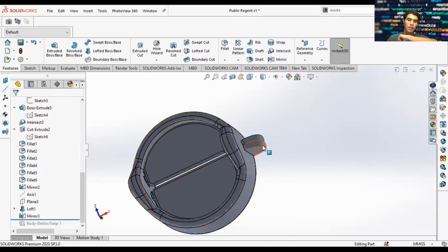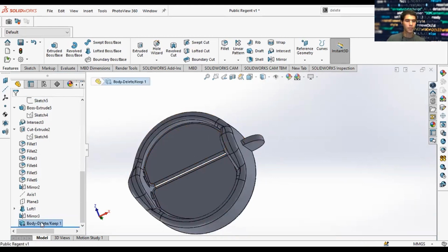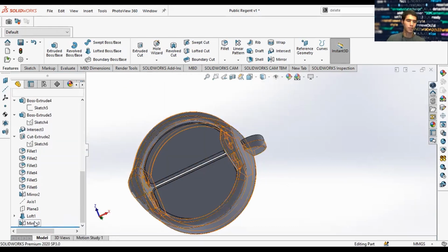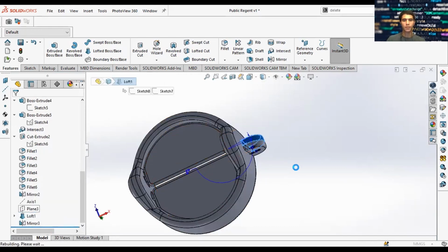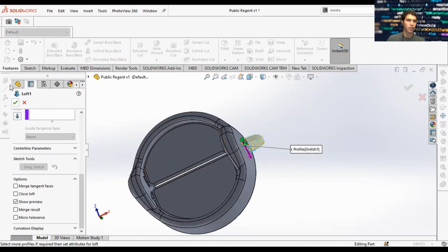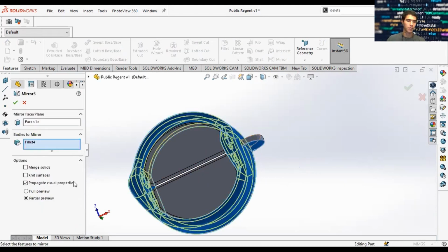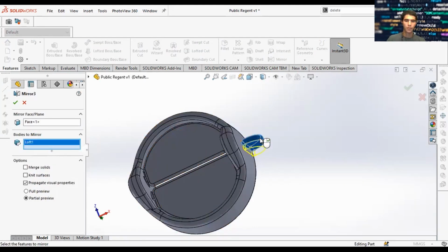Here we have our loft, and we want to revolve this around, let's stick with this. Back to our loft. There we go. That should change it. Now we go check our mirror bodies. Good.